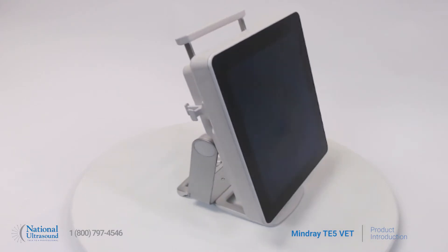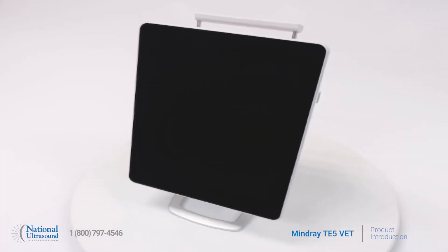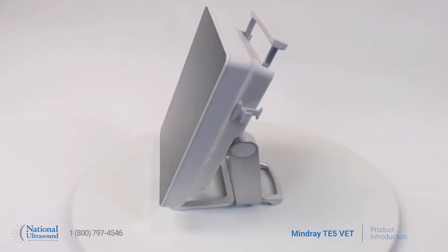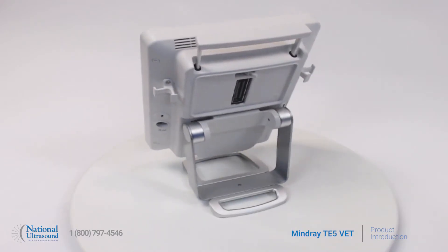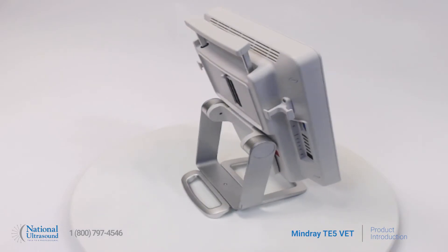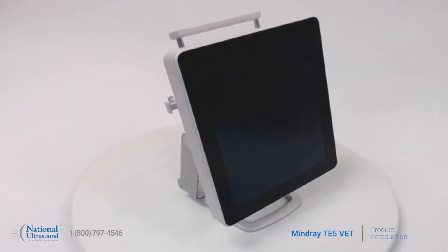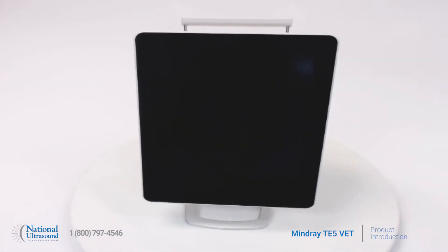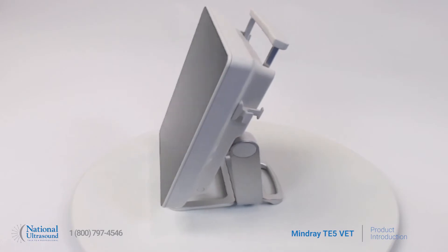The new Mindray TE5 vet ultrasound machine is a comprehensive solution that caters to a wide variety of animal species, ranging from small companion to large animals and everything in between. Mindray has updated this popular tablet to be a full solution for veterinary cardiac imaging while still providing excellent abdominal, small parts, and musculoskeletal imaging.